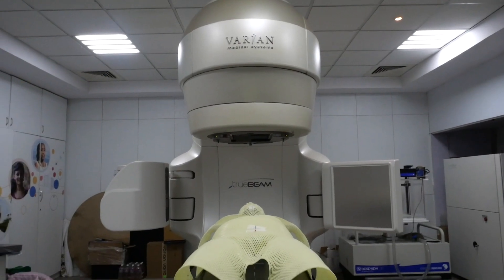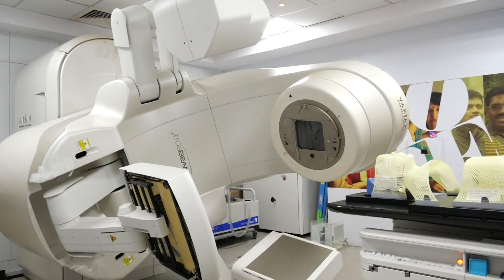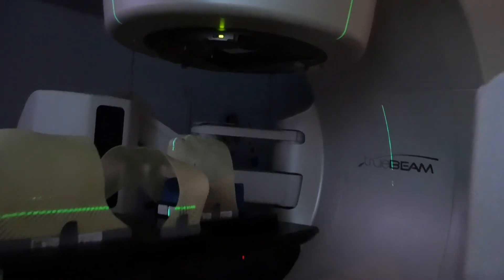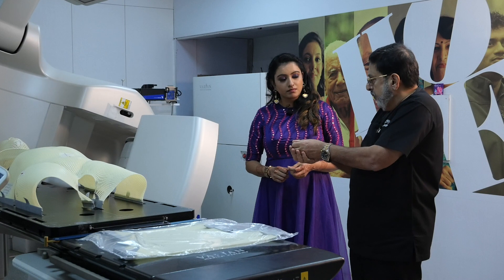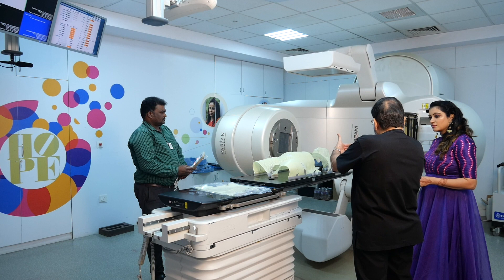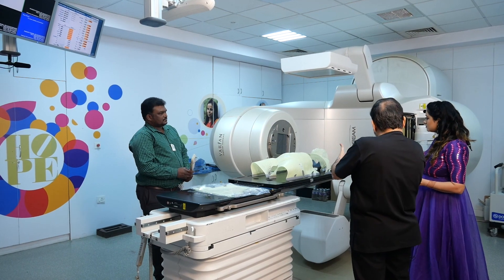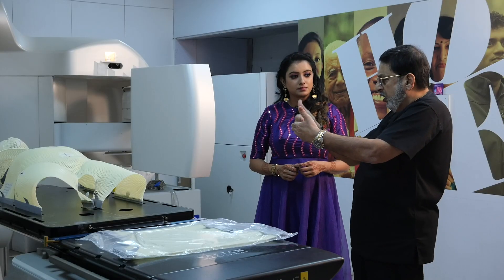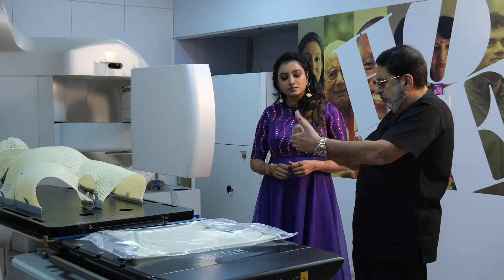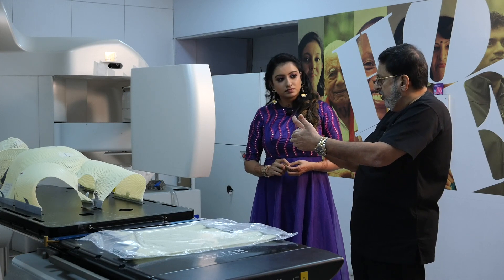Once the couch goes inside, that is where the radiation is delivered. There are two x-ray facilities — a cone beam CT — which helps us take an image of the patient. Once we grab the image of the patient, we know exactly where the position is. We try to fuse the CT scan done on the first day with the cone beam CT done on the day of treatment. Once you have fused the images, you know exactly the place which you are supposed to treat.